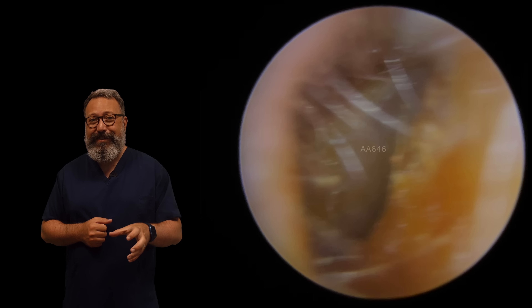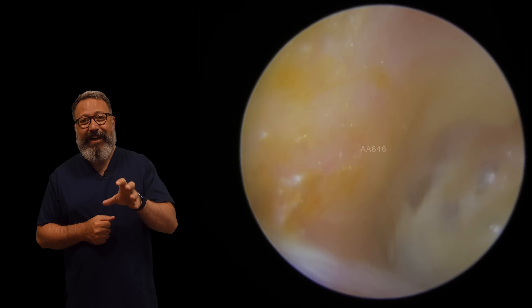I've had to drop right the way back with the endoscope to be able to show you what that looks like. So we were saying how long that plug was - that was a fair old length.